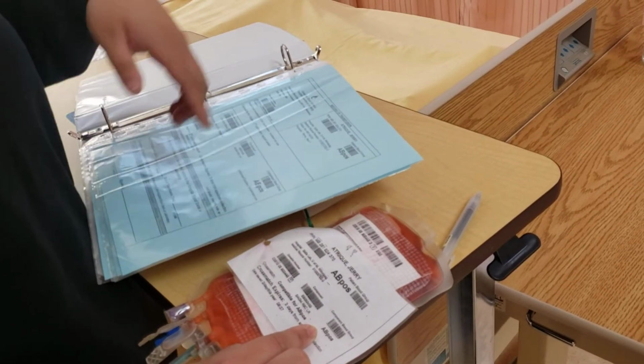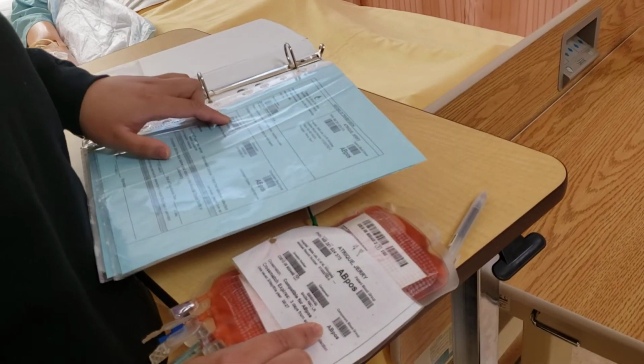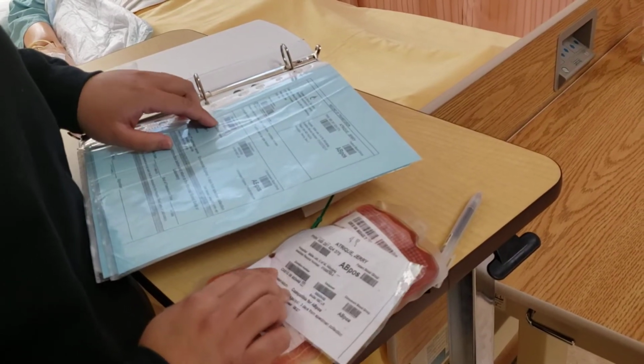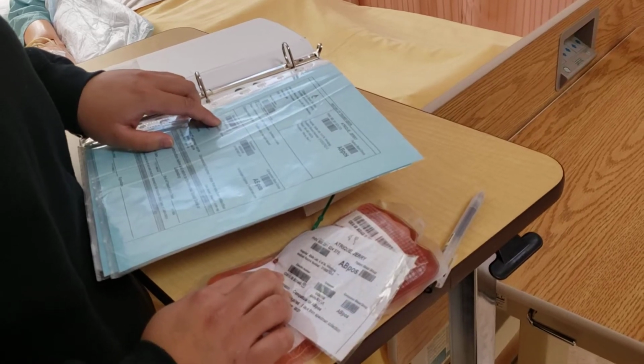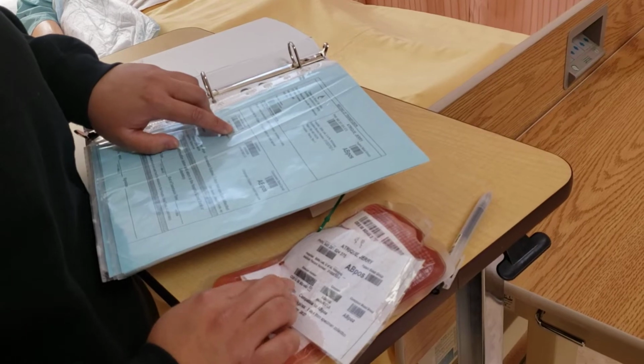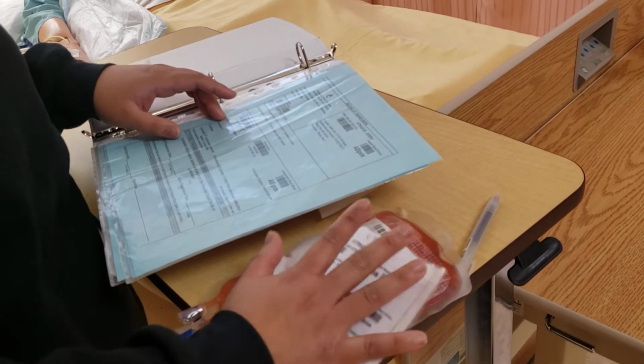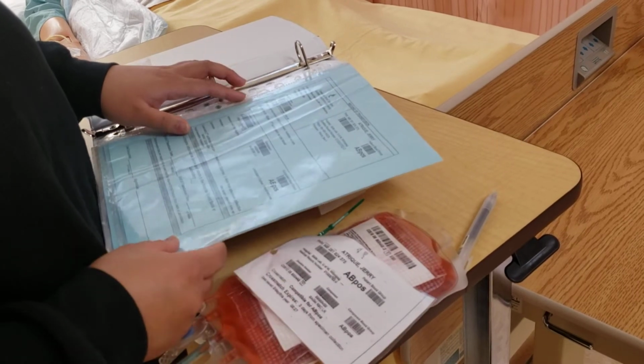The component blood group is compatible with the patient's blood group, as well as we want to look at the donation number. So it's Z051008900445, Y in a box. And then the second nurse would acknowledge if everything is correct.